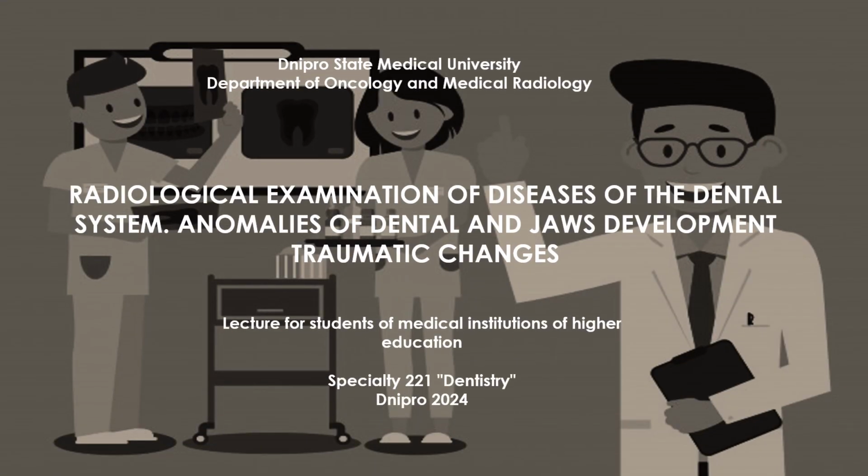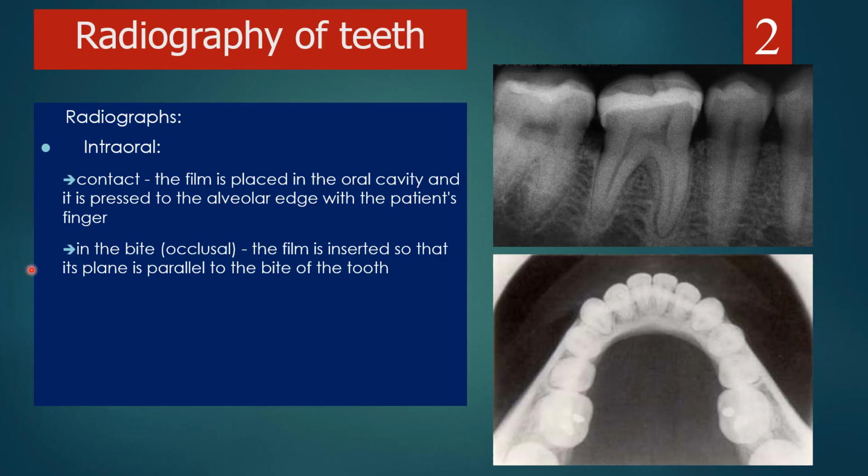We are glad to present to you our lecture, Radiological Examination of Diseases of the Dental System, Anomalies of Dental and Jaw's Development, and the Traumatic Changes. And we start from examinations.